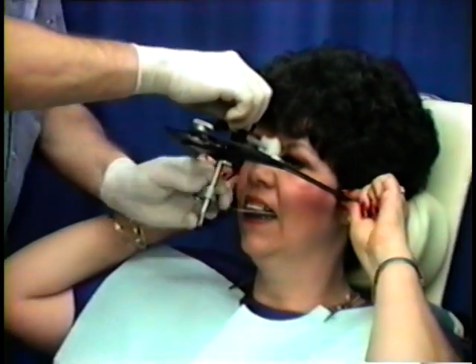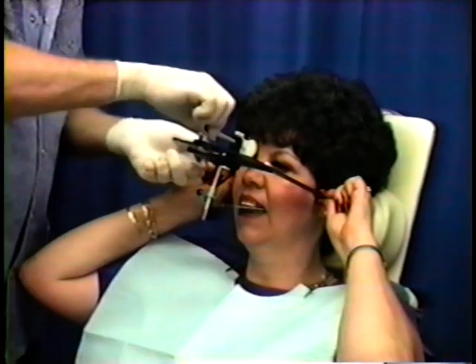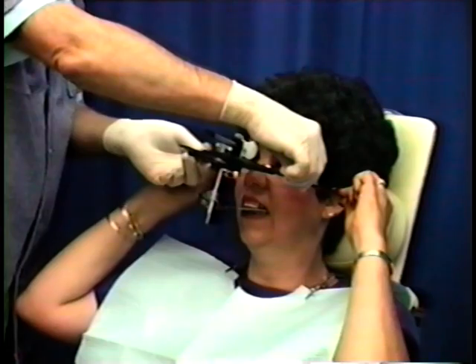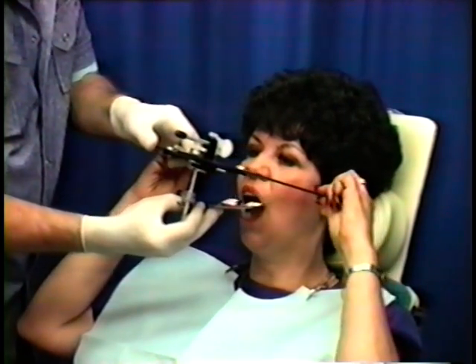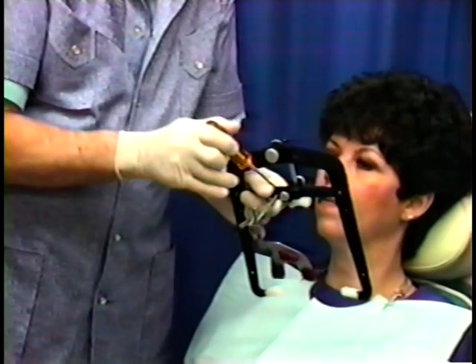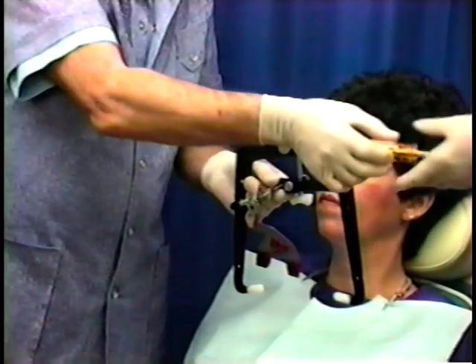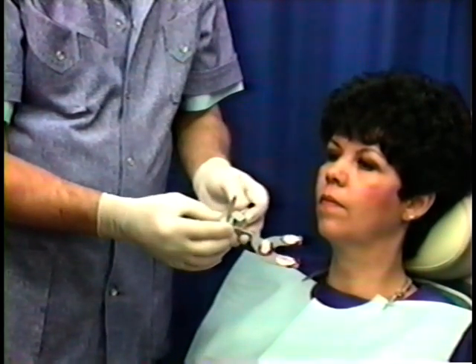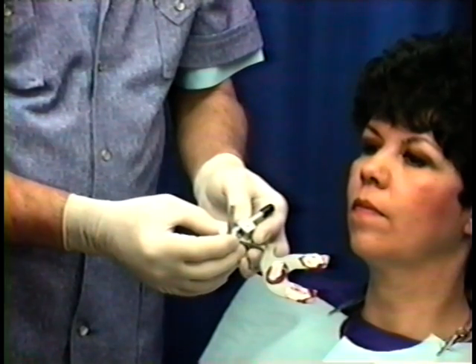Next, release the nasion. Then release the large lock screw and have the patient retract the ear plugs. The patient is instructed to open the mouth and we take the face bow away. Immediately loosen the set screw, or lock screw, that holds the bite fork assembly. The bite fork assembly is removed and can now be sent to the laboratory for mounting the maxillary cast on the articulator.